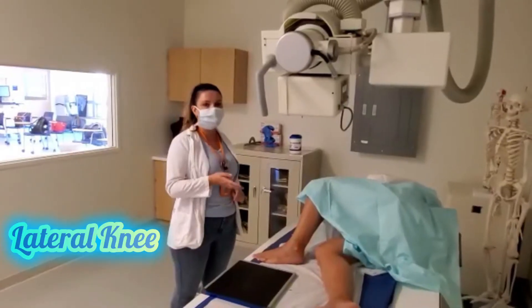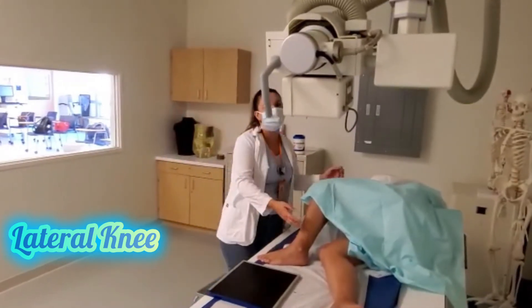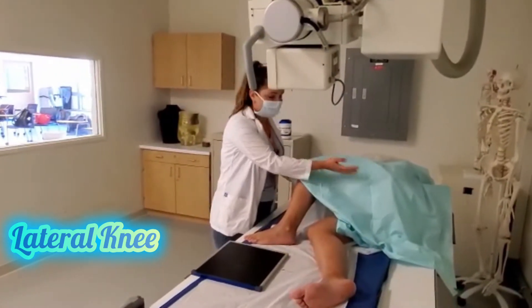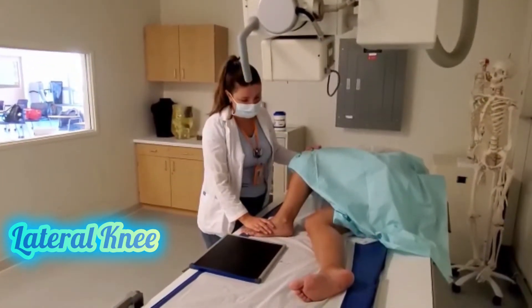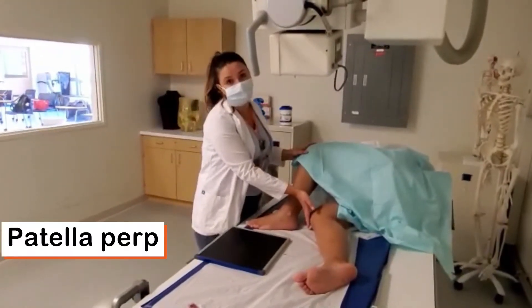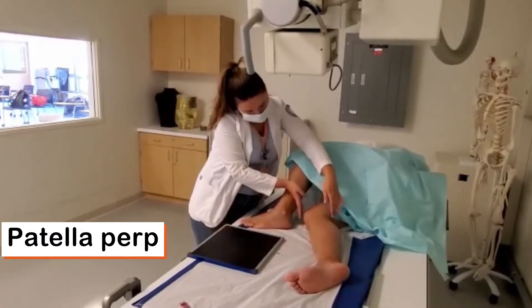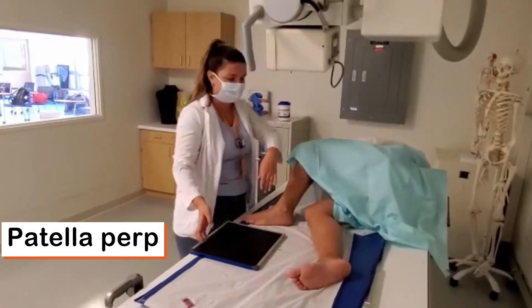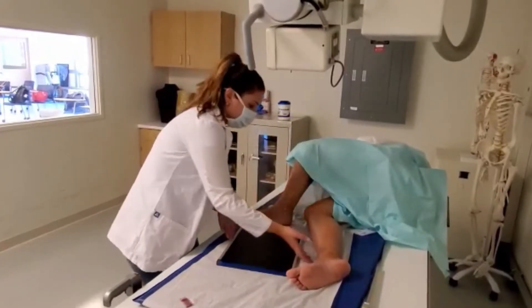For the lateral position of the knee, we turn the patient towards the affected side. We bring the other leg forward to make sure the patient has support. This way we also confirm that the affected knee is in a true lateral position. We can see that by ensuring the patella is perpendicular to the table. The knee is flexed 20 to 30 degrees.